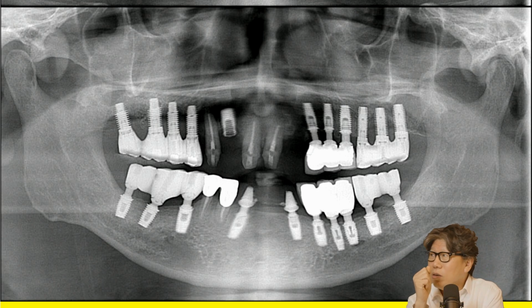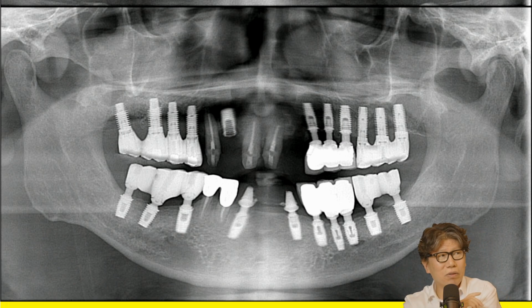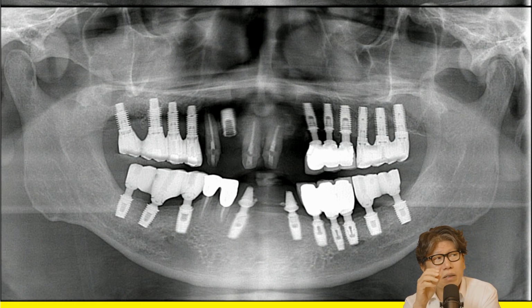So now a lot of people ask me, how did the bone come up? Did you do anything special to the implant? And it's not like that. It's just supposed to come up, normally, as long as I don't get in the way. If you have a partial denture here, things get more difficult. You've got this locking taper here. You've got a screw-type implant here, and you've got micromobility. It's not going to come up, no way. There's no mobility in the abutment connection structure. So this is what's holding it up.